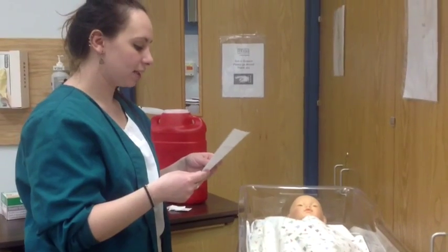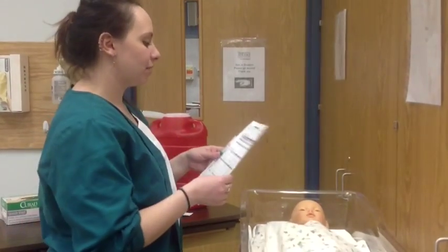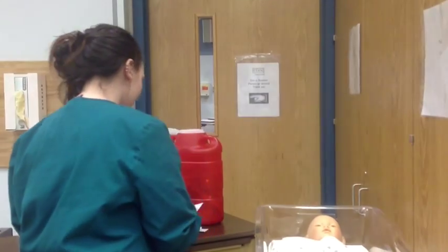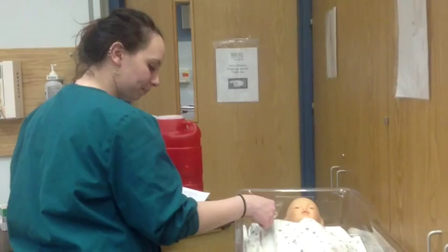You want to then tell the parents, I'm here to give your baby 0.5 ml of the IM injection on the vastus lateralis, which is the muscle on the side of the leg, because most parents probably won't know the Latin phrase. So double check all that, and then you want to provide the privacy. We have a single room, so it works out okay. So I'm going to take my MAR, and then I double checked everything with the baby.